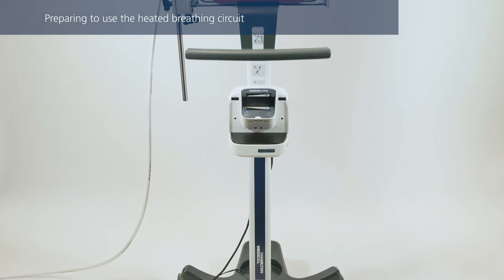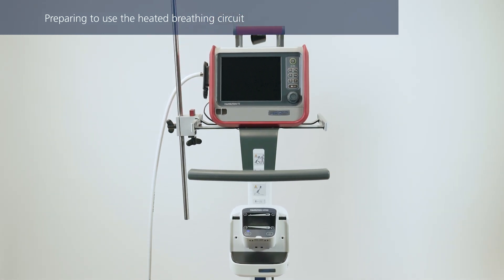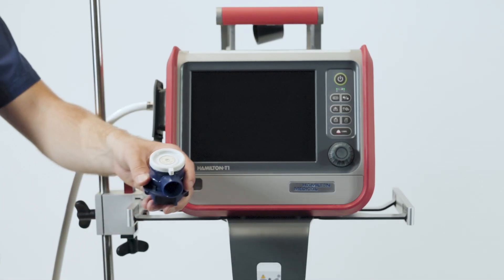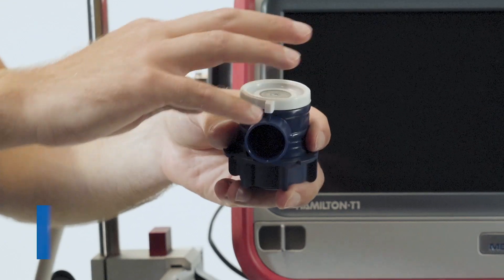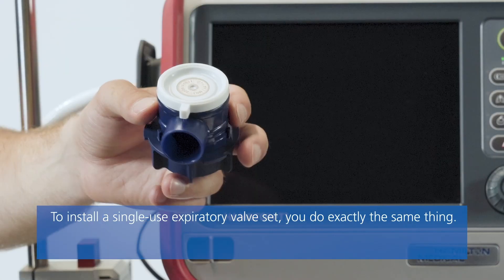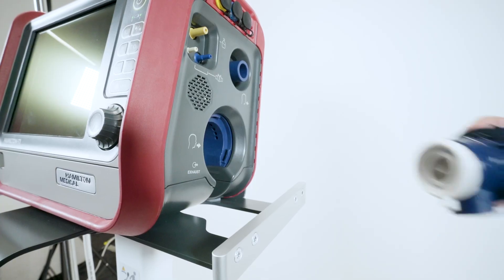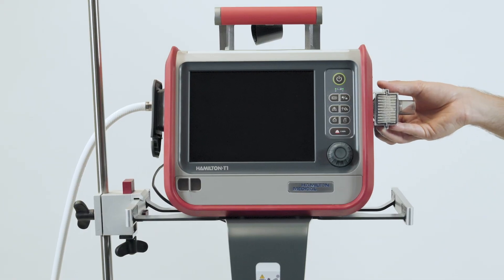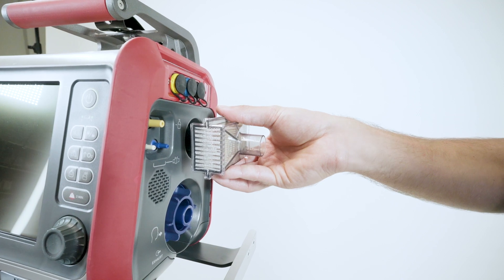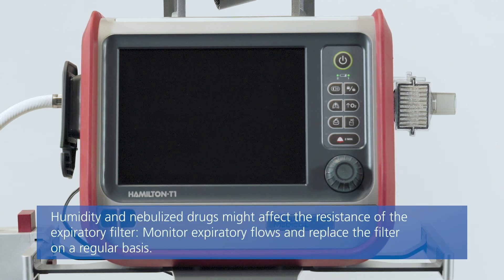If you are using a heated breathing circuit, choose the correct circuit and expiratory valve set according to the patient group or selected treatment. First, install the expiratory valve set. If you are using an autoclavable expiratory valve set, you need to assemble it first by placing the silicone membrane onto the expiratory valve housing; the metal plate should be facing upwards and be visible. Position the valve in the expiratory port, ensuring it is straight, and twist it clockwise until it locks into place. To prevent patient or ventilator contamination, connect a bacterial and viral filter between the patient and the inspiratory port. An expiratory filter is not required, but you might use one for infection control according to your institution's protocol.